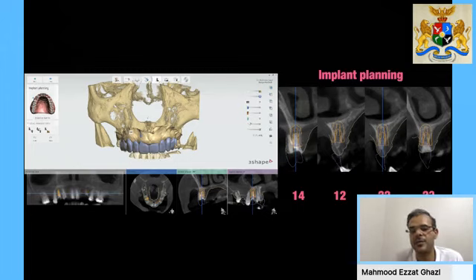So in the anterior areas, we went for a screw-retained abutment, over it a cemented crown, putting in mind that, of course, on the screw-retained abutment, we adjusted our finish lines of the abutments to be equigingival so that we do not have any excess cement ingress within the soft tissue. And of course, the abutment to implant interface was about 3 millimeters from our new zenith, so that we do not have any soft tissue or bone loss in the future.